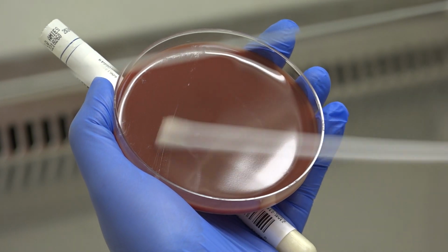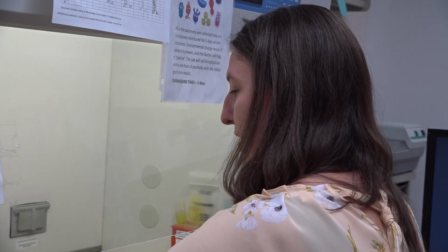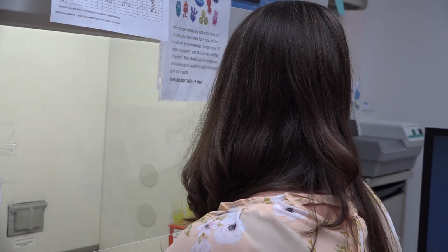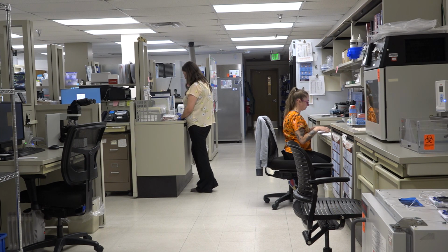While some test results can run in as little as 15 to 20 minutes, others can take hours or even days if a culture is growing. For people who work in the EPH lab, their love of science is combined with their passion for healthcare.